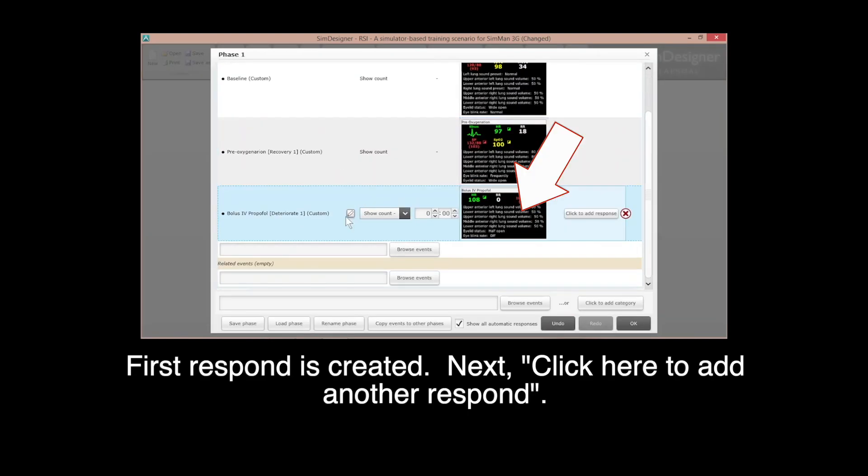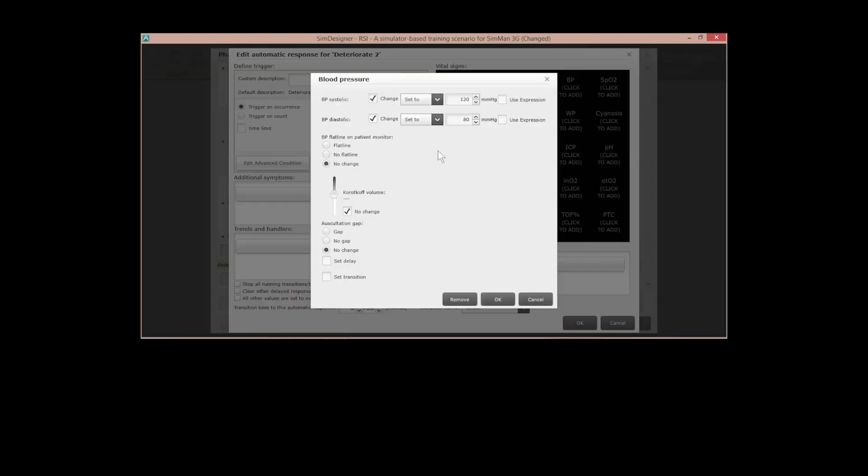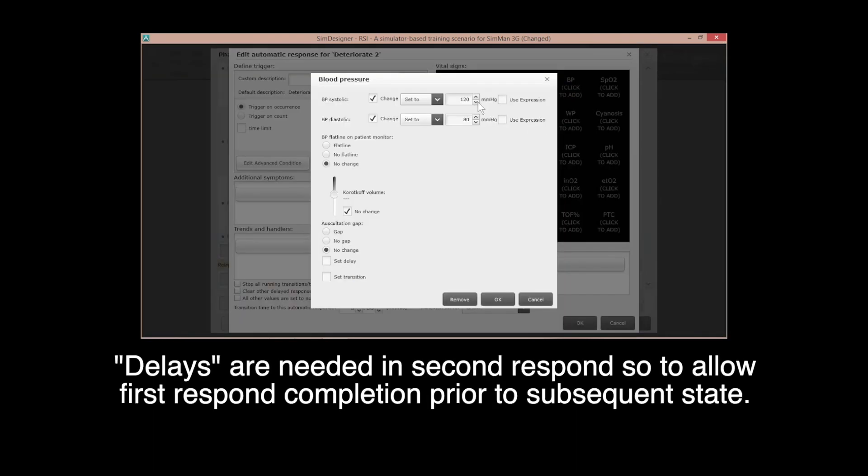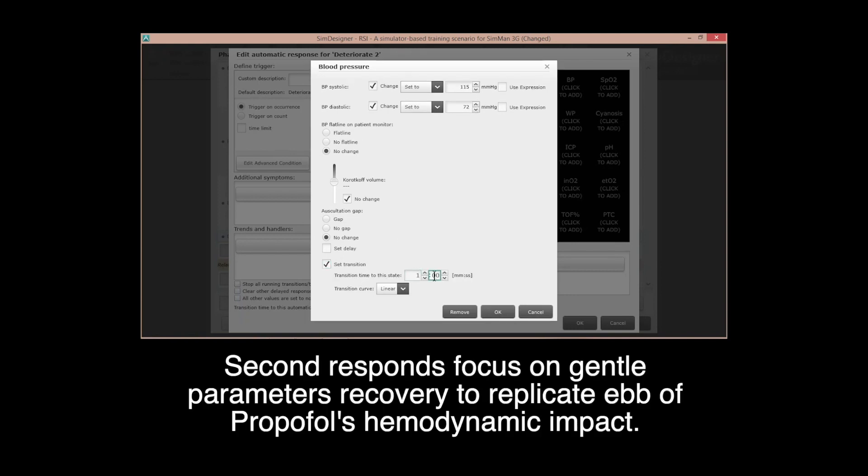Next, click here to add another response. Delays are needed in second response, so to allow first response completion prior to subsequent state. Second response focuses on gentle parameters recovery to replicate offset of propofol hemodynamic impact.